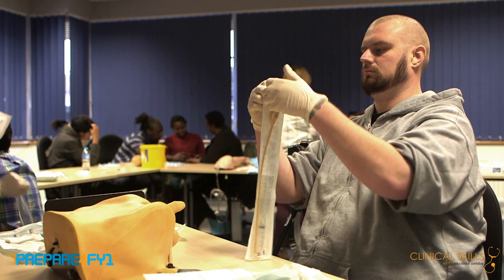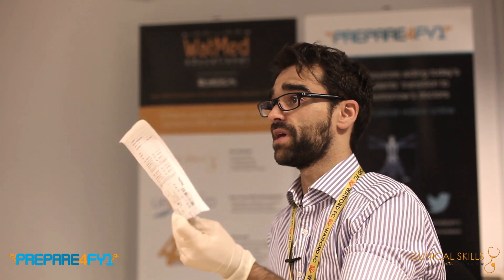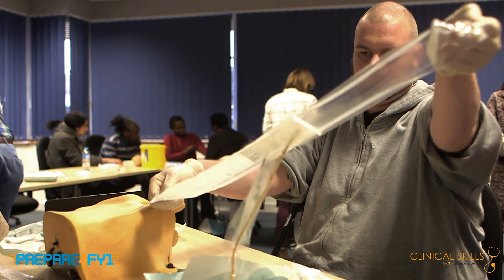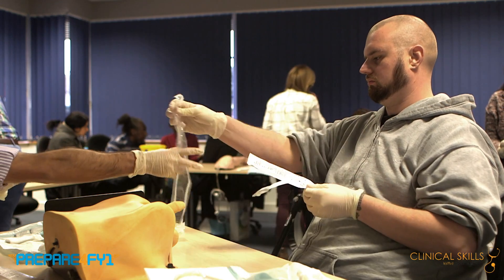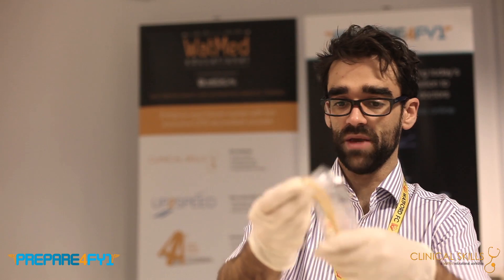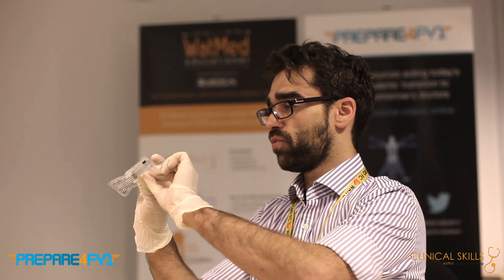So you haven't de-sterilised anything. Get rid of the plastic bit — rip this — and keep the stickers, because it's really important that these are documented in the notes. Get rid of the plastic sleeve but keep the labels. You've got most of your kit ready: get the catheter, keep it in its plastic sheath, and put it in the kidney dish. Then get the water ready for injection.